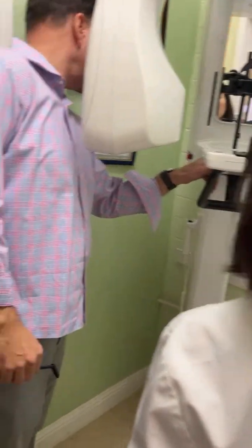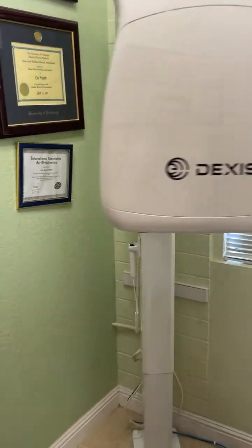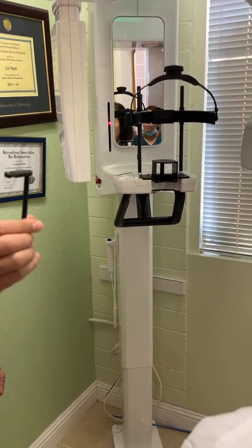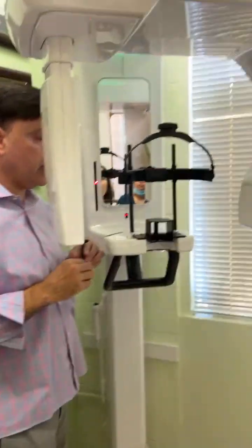Right here, I have it. So let's get this rotated. Let's hit the home button, so the machine knows you're setting up now for a panoramic X-ray, no longer doing a 2D. I'm sorry, 3D. Okay. Green. Good. Green is your friend.